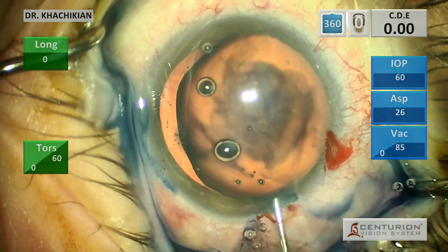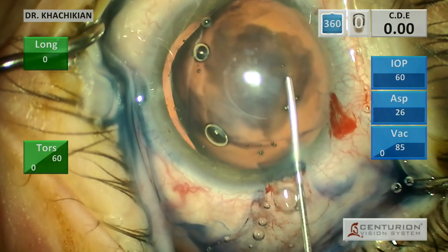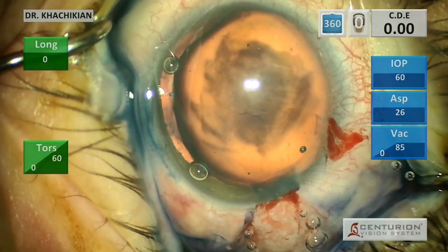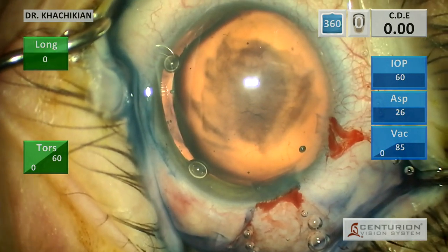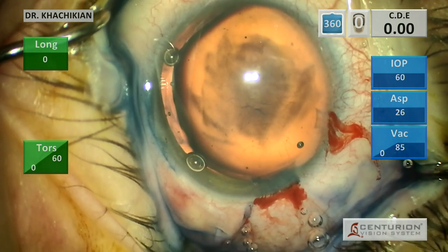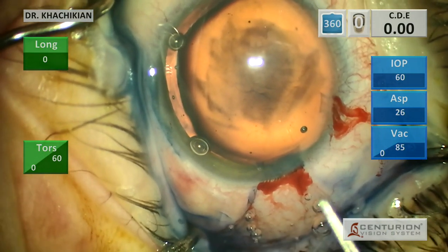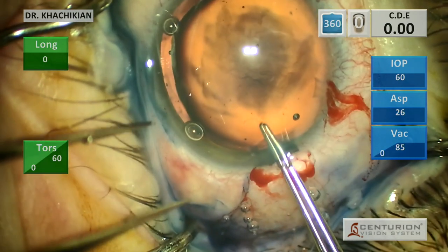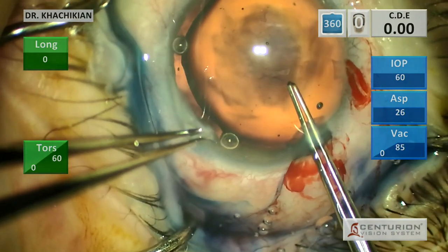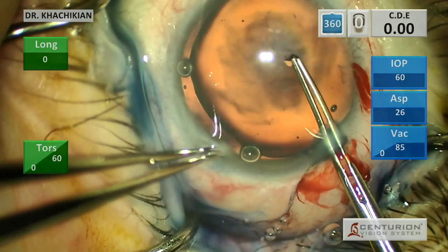In cases like this, when I stain I like to paint the trypan blue onto the surface and then refill with viscoelastic. I try to be really generous with the viscoelastic in these cases, especially since this one is somewhat unplanned. Usually I put a case like this at the end of the day, but this came up right in the middle of the day, so we just have to be really smart with our time.